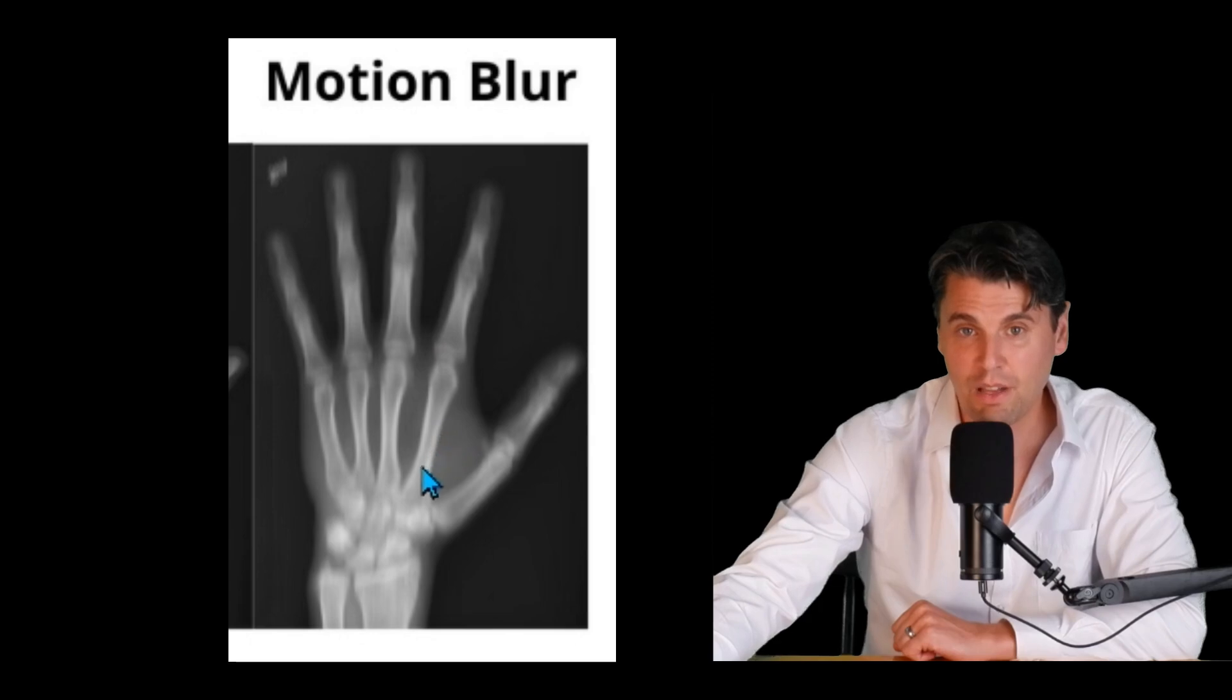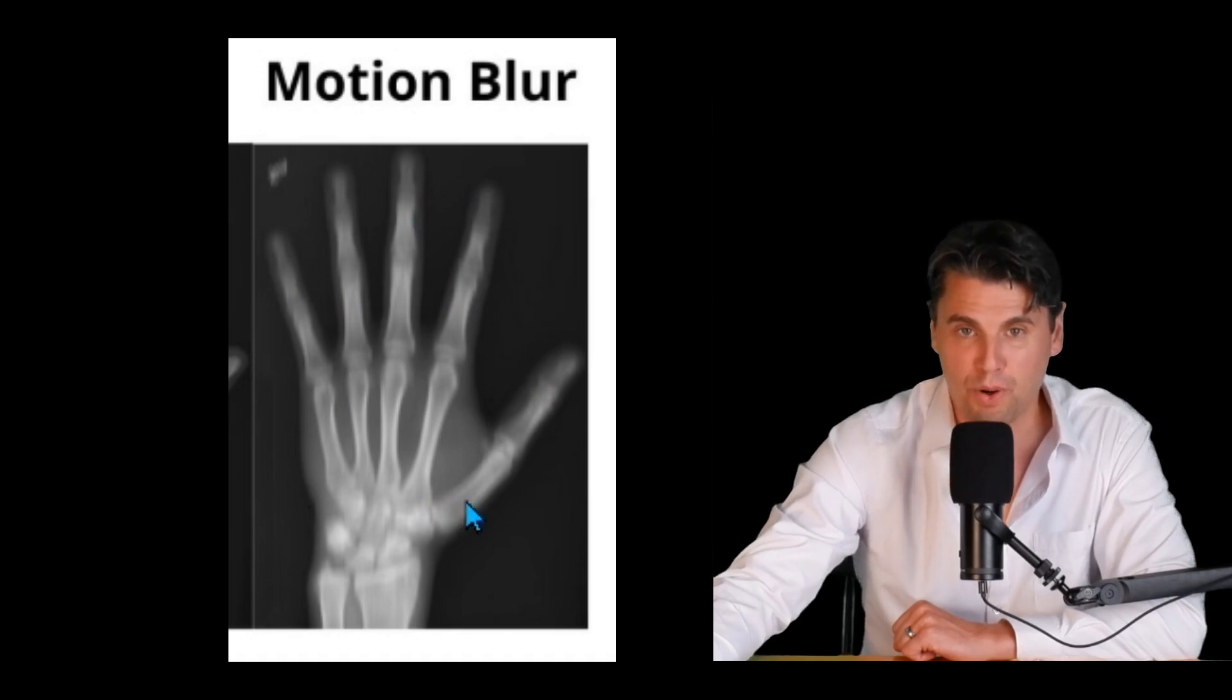This is kind of an extreme example. But you can see the edges of the bone going in the up-down direction are decently preserved here. But it's very difficult to appreciate the edges in the left-right direction in the image because those were blurred out.